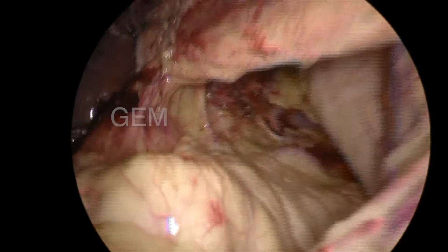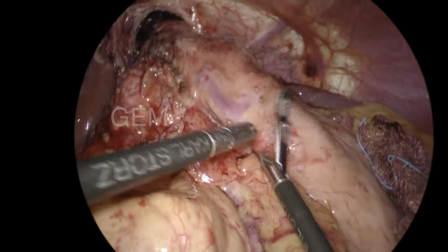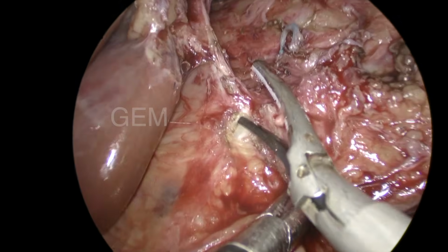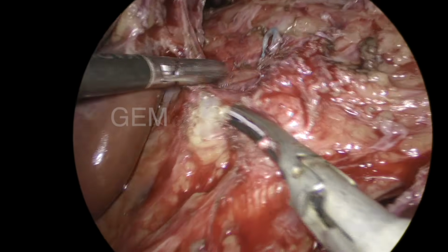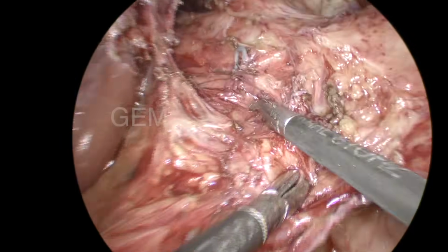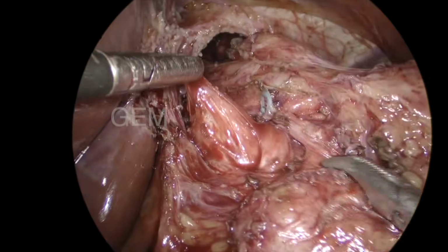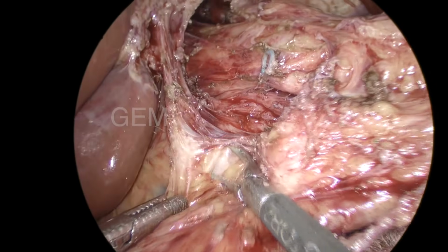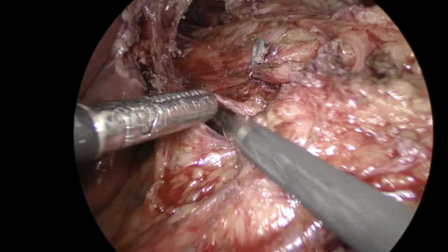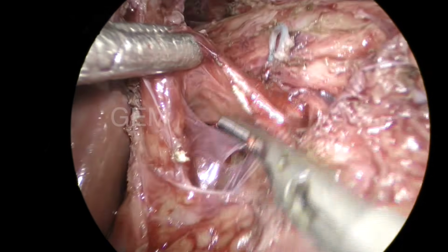So I am not dividing any structure now. I thought, okay, this has to be divided. Then only I can see, so I am coming from this side. The right crus and this attachment have to be divided. Then only will I be able to see the edge of the fundus. You can see the dissector, the usefulness of the curved dissector. This cannot be done with the harmonic. So I am dissecting, and I could see the fundus wall and then the fibrous tissue adhesions.